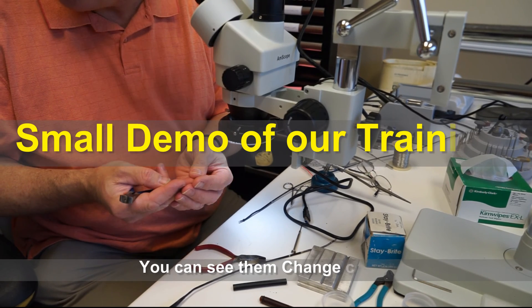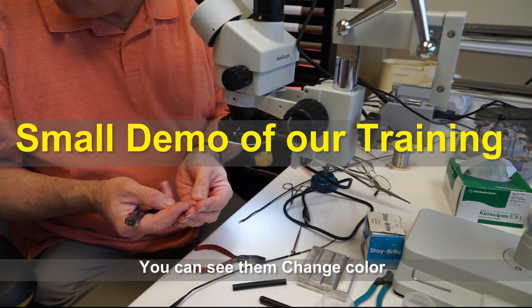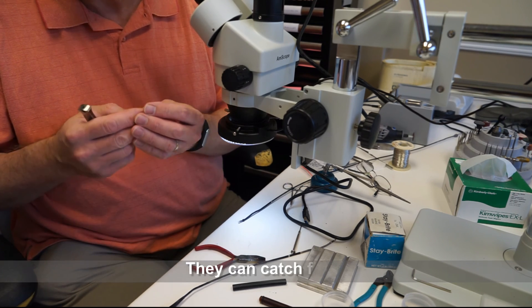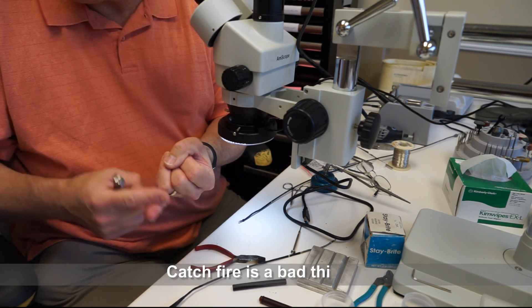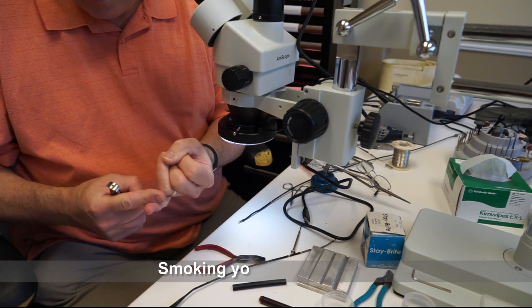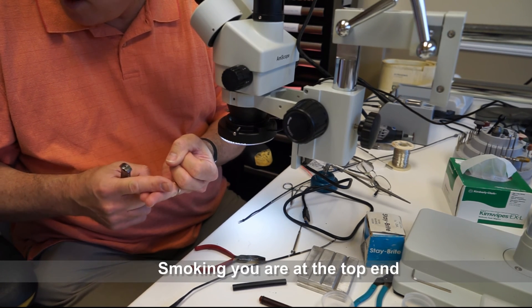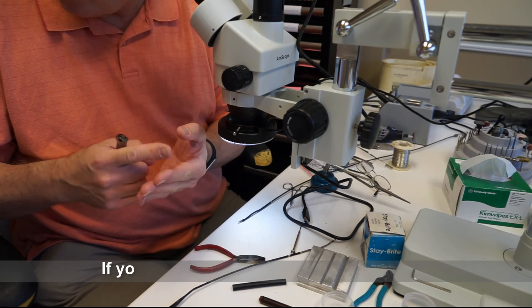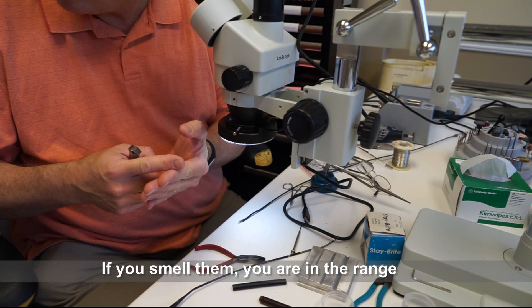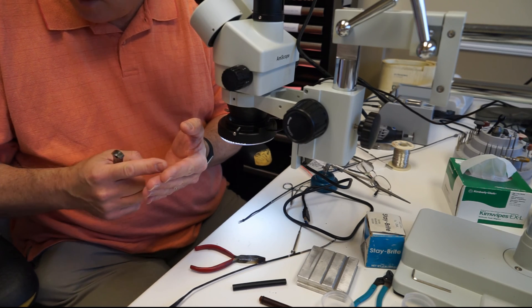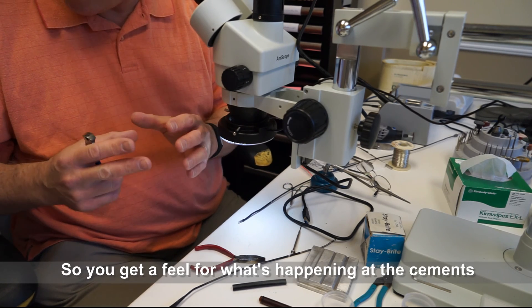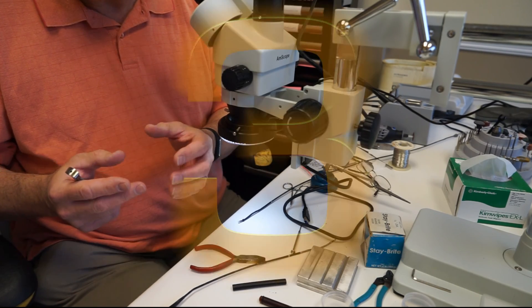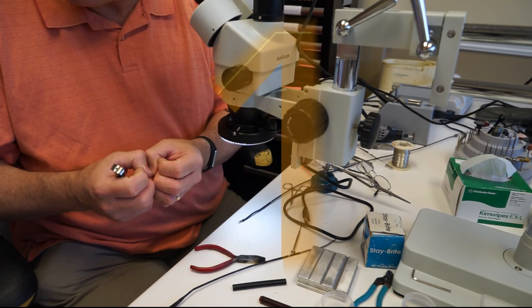You can see them change color, they can start smoking, they can catch fire. Catch fire is a bad thing. Smoking, you're at the top end. If they change color, that's okay. And if you smell them, you're in the range. So you get a feel for what's happening with the cements. You want to break the bond, but you don't want to scorch the optics.